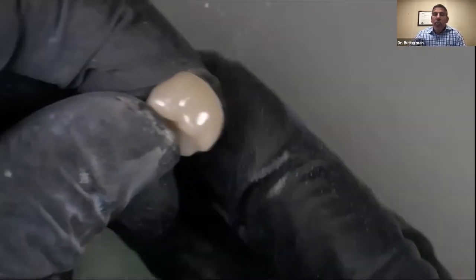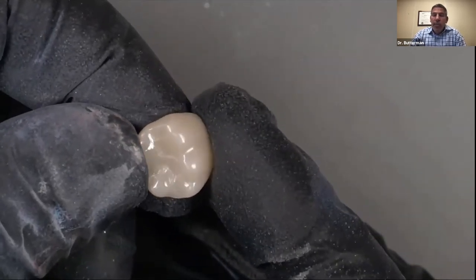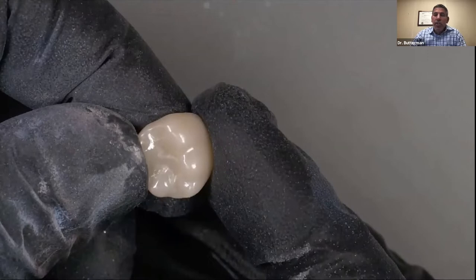And now, yes, it's shiny. Yes, it looks almost glazed, but the point of this is that I don't want to cause damage to the antagonist tooth. So if I would have left this a little bit rougher, and maybe I would have put a glaze on top of it, then eventually that glaze is probably going to come off. Glaze on zirconia just typically doesn't last that long. And once it comes off, you're going to have a rough surface underneath there. So you just have to have that smooth surface.